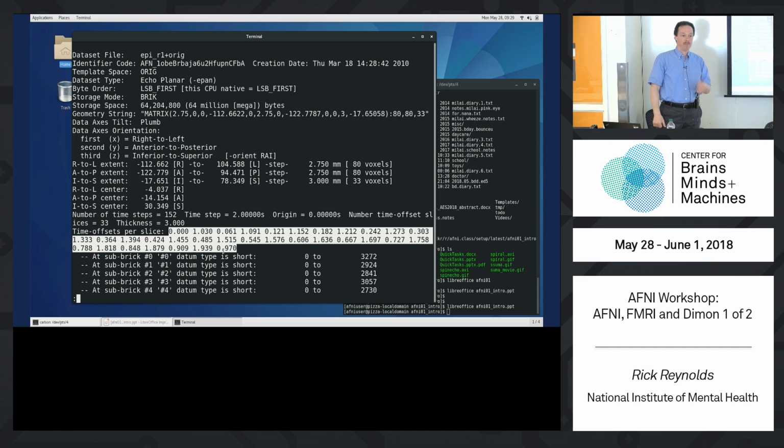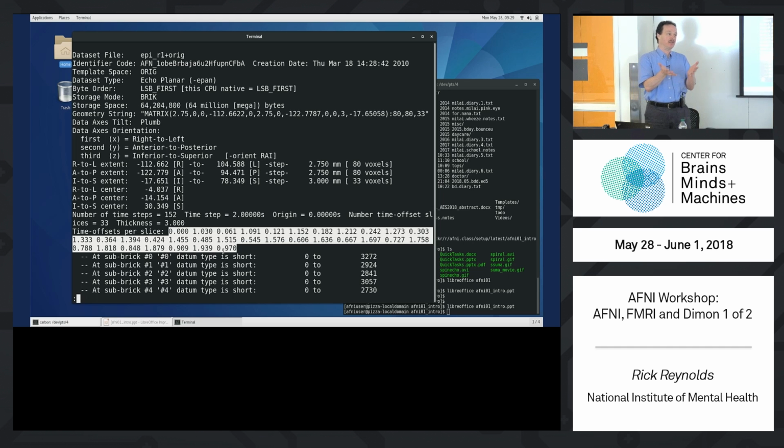So I guess as a rat person, we collect 5 minutes of baseline, of nothing, before we can start our experiment. So sure. That threw me off. Right, it would only be 5 minutes. So for rats, for example, they're fixed in a rigid position and maybe anesthetized, and so they're not going to move. You don't have to worry about that too much. With humans, people start whining if you bolt them into the scanner, and it's a terrible problem. So it's hard to keep still for that long if you're collecting human data. So that's another reason the runs are a little shorter.